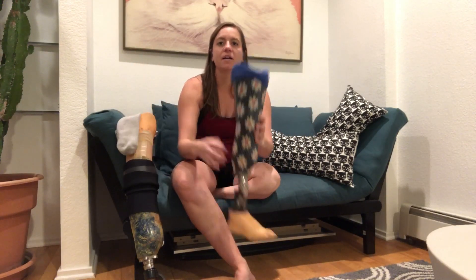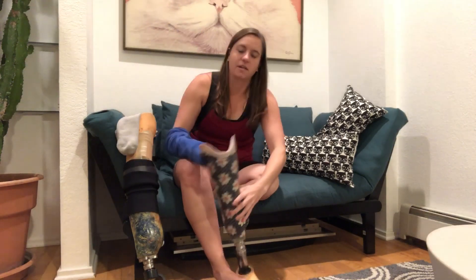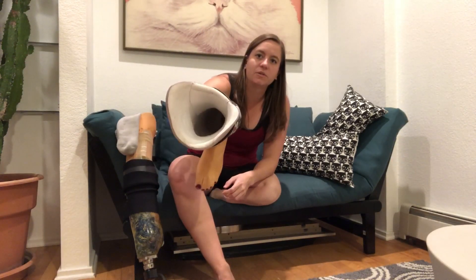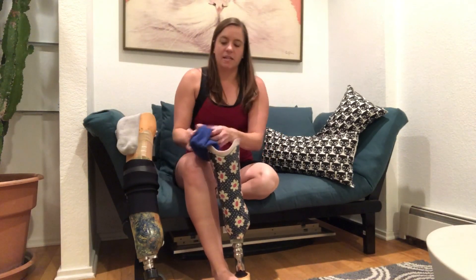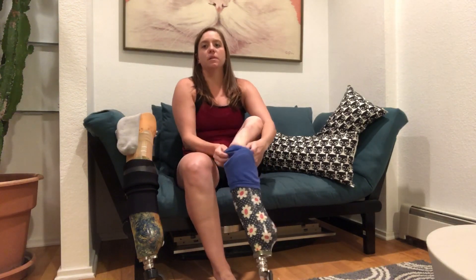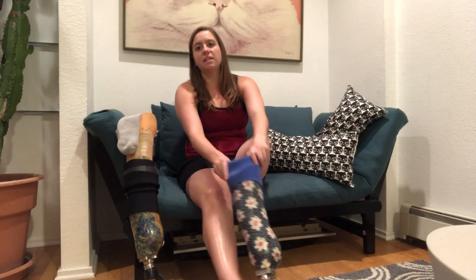So my house leg is this leg right here, and it has a sock that goes right into this foam layer that's in the prosthesis. That sock can just stay in there and kind of wraps over the top, and I'm able to just pop that leg right on. It's very simple and very easy to take off and put back on.